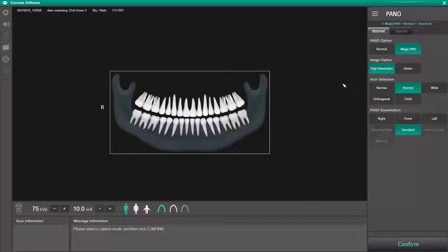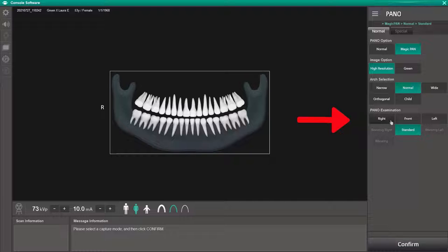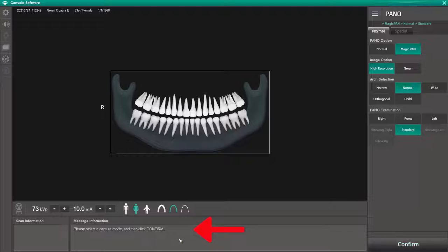Next, select an arch size option: narrow, normal, or wide. Moving down further to panel examination area, standard is your default capturing all dentition and condyles. Additional options include right side only, left side only, and front. Also notice the message information area on the bottom left of the screen, always displaying the status and next steps.